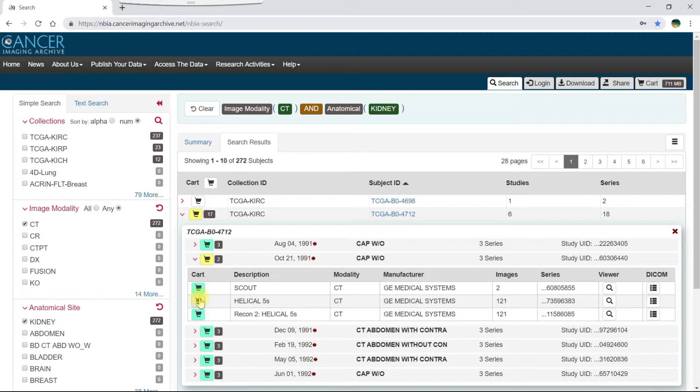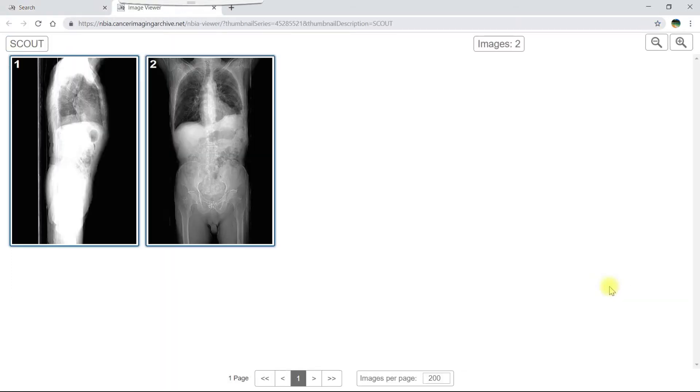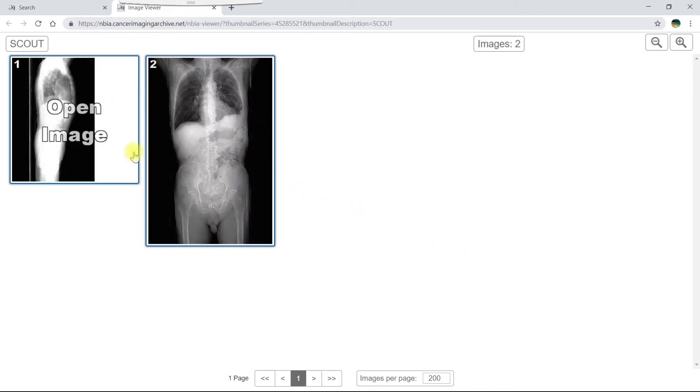In the list of series or scans, two other features are available. You can click the magnifying glass button to view thumbnails of all the images in that series. Left-click any of these images to save the DICOM file to your computer.